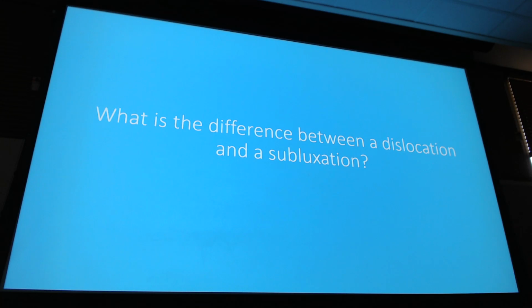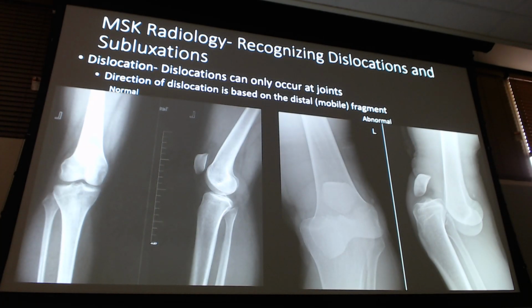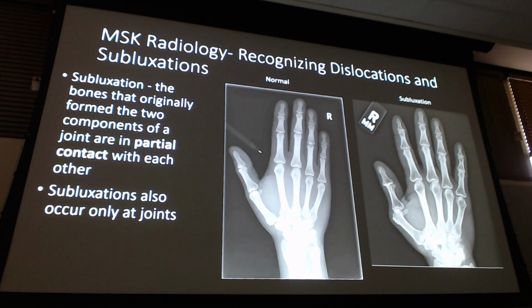Right, we just covered that. Okay, now let's go back to this one. We're talking about this dislocation, subluxation. Sorry, I promised you this. That pen, don't worry about that. This patient basically had pain in this region. So sometimes on x-rays, the tech is really nice. They will put a little pointer or a pen there so the radiologist knows where the pain's at. They'll ask the patient, just in case your history just said hand pain, right? And the patient will say, it's right here. So that's not pointing out an abnormality. That's them telling the radiologist, hey, this is where they hurt.